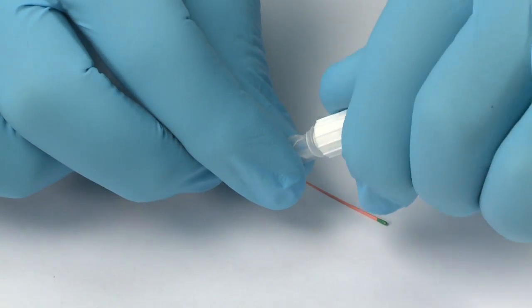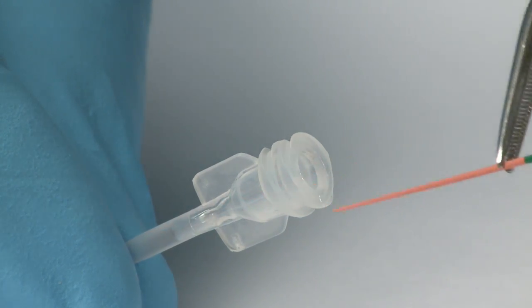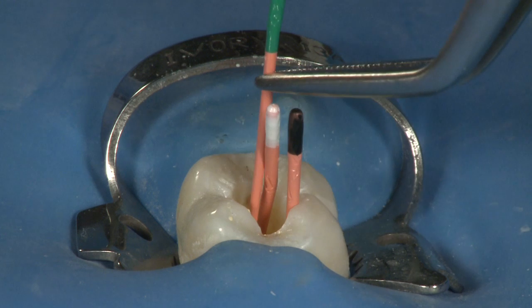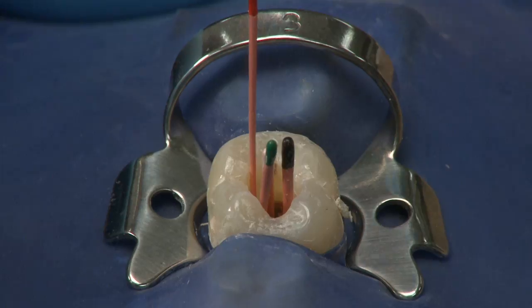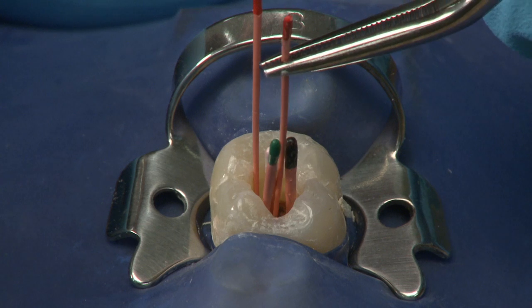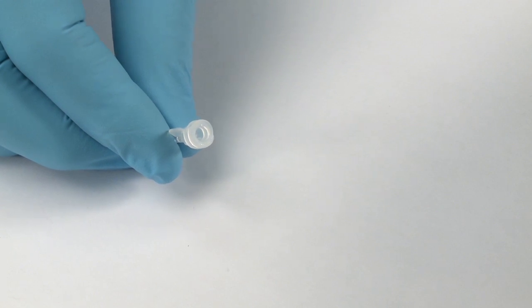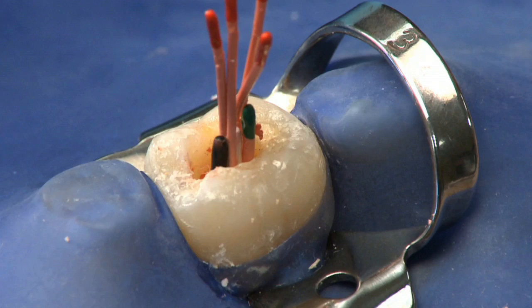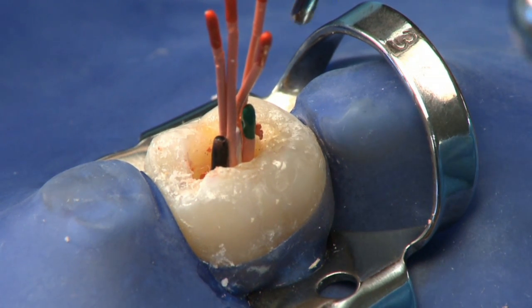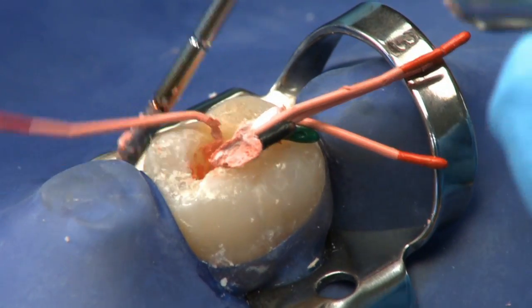Using cotton forceps, place an EndoRes gutta percha point into the chemical. Please note: if you use Accelerator on the master EndoRes point, you will need to move quickly for radiographic confirmation, as the Accelerator will cause the EndoRes to polymerize in less than 5 minutes. When using accessory points, use a minimum of 2-3 points to assure a rapid and complete set. Once you have placed all of the gutta percha points that you desire, replace the cap on the EndoRes Accelerator vial and dispose of the vial. After 5 minutes have elapsed, test the set of the sealer, then use a heated instrument or searing device to trim the excess gutta percha. When trimming the gutta percha, take care that you don't inadvertently dislodge the cones from the canal.